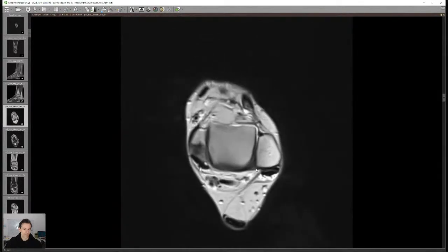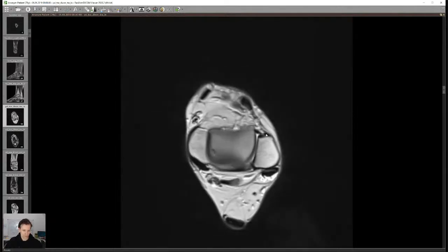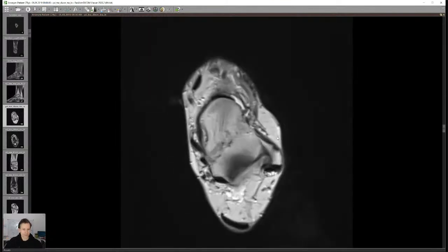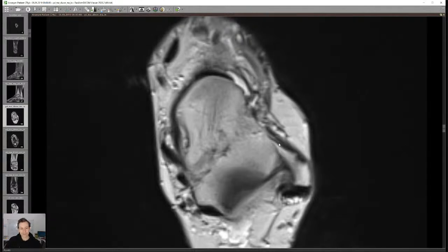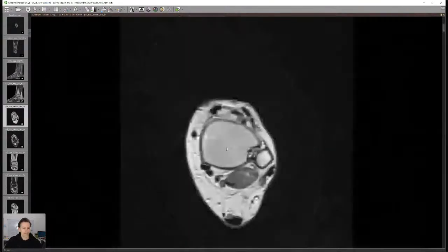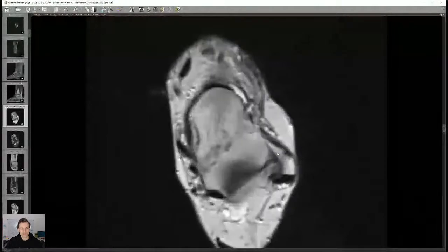Then describe the lateral or medial ligaments. I typically start with the lateral ligaments since I'm already scrolling in that direction. Almost everyone has had ankle distortions at some point, so ligaments are often a little scarred, a little thicker, a little brighter than in a young patient. If it's not super smooth black it's probably fine to call it a little bit scarred. As long as you don't see edema and fibers are in continuity, it's not an acute injury.